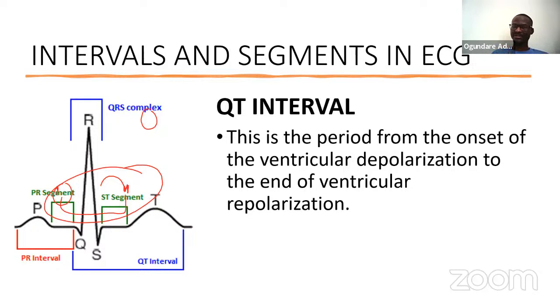And once again, if you don't understand all these fundamental things, this is when ECG interpretation becomes overwhelming and mysterious. Because there's no way you can build on a faulty foundation. If you don't know what the QT interval is, then I'm afraid you won't be able to go anywhere with your interpretation.